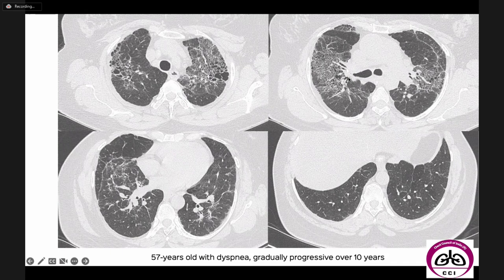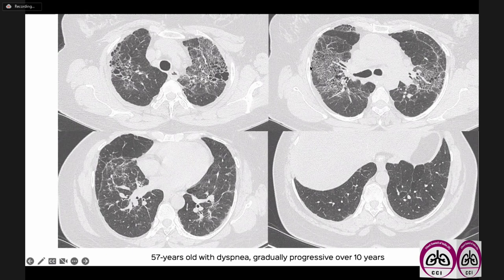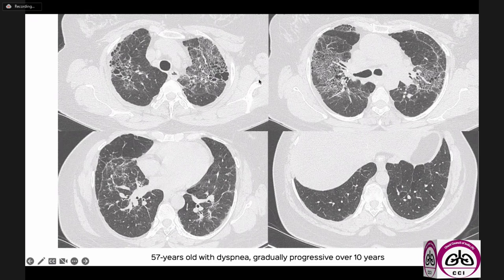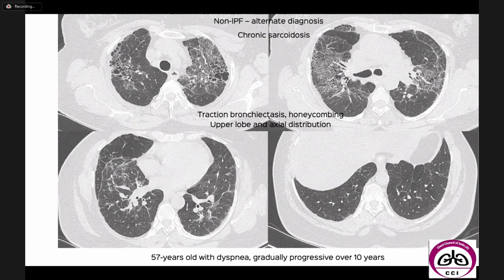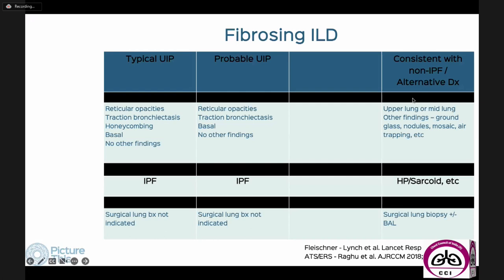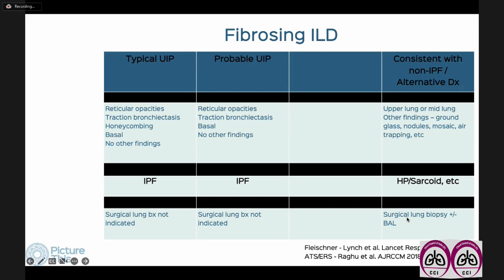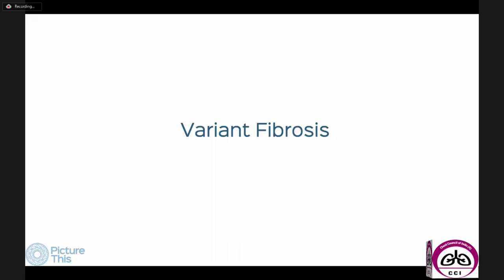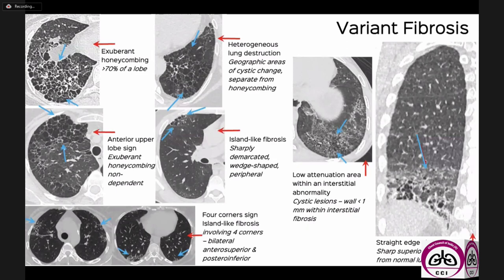This is non-IPF fibrotic hypersensitivity pneumonitis. On the other hand, this patient has an axial distribution with honeycombing in the upper lobes — non-dependent and extensive traction bronchiectasis but upper and mid-zone predominant, not subpleural basal — with additional findings. This is again non-IPF, and this pattern is very typical of chronic pulmonary sarcoidosis. In some instances a lung biopsy may be needed, but most of the time when we properly identify all these patterns, a biopsy isn't always necessary.